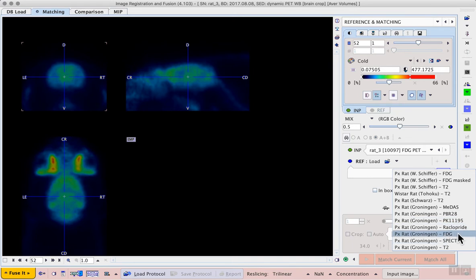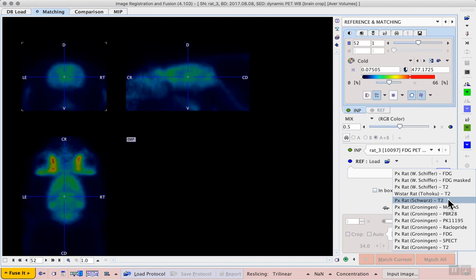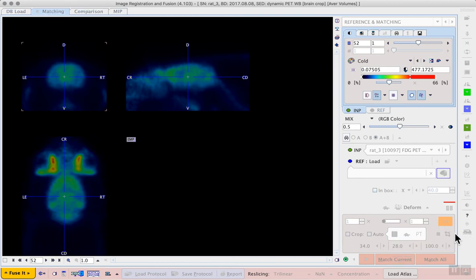Lower down, we have an FDG template corresponding to the PX-RAT Groningen template set, which corresponds to the PX-RAT Schwarz MRI and Atlas. For this example, I will use the FDG for PX-RAT Groningen.